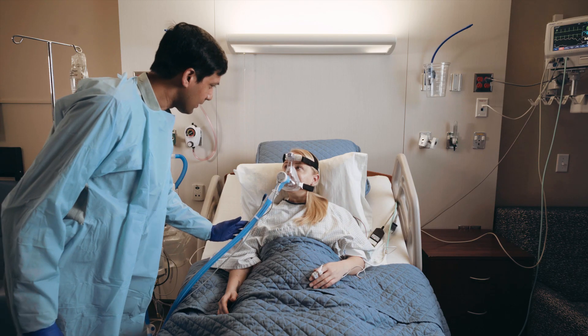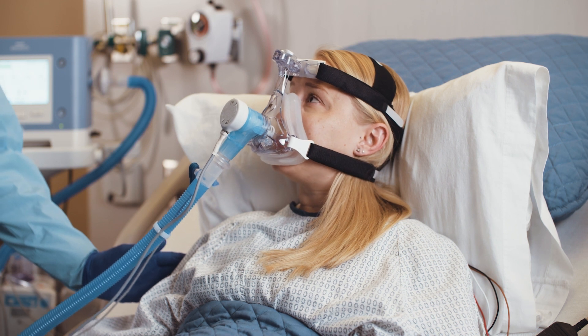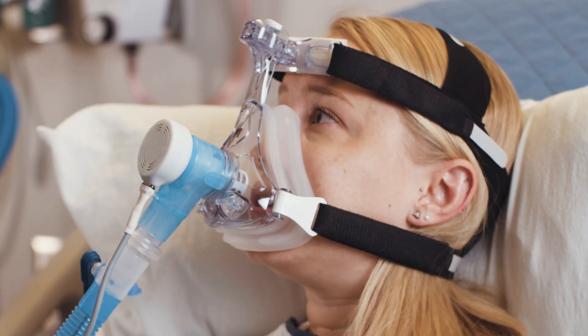Can you hear me now? Yes, I can. I'm really, really uncomfortable. I really need some pain medicine. Can you get that for me? Absolutely, I will get some for you. Thank you.